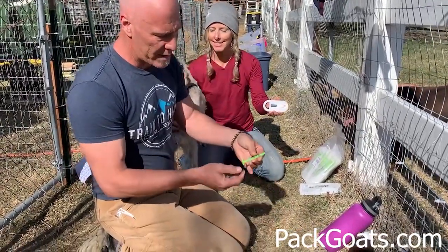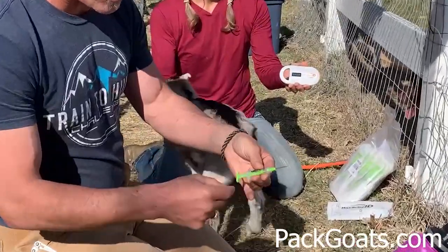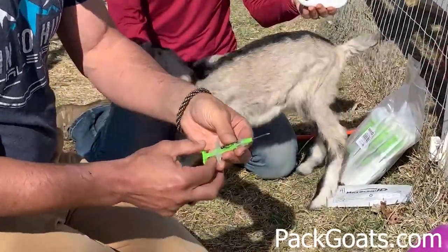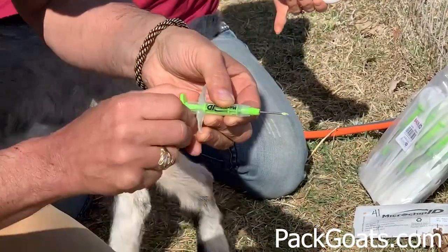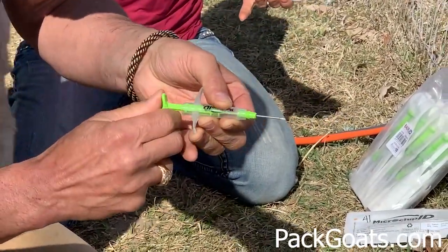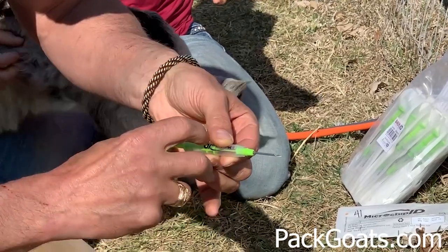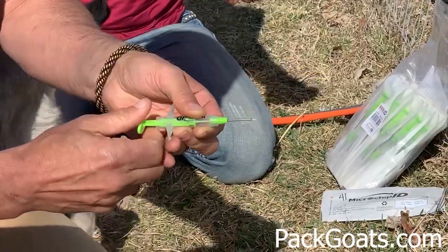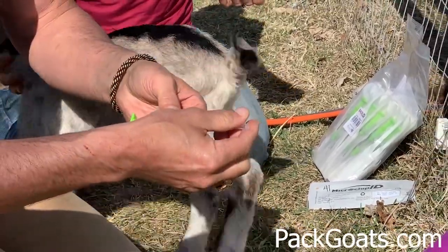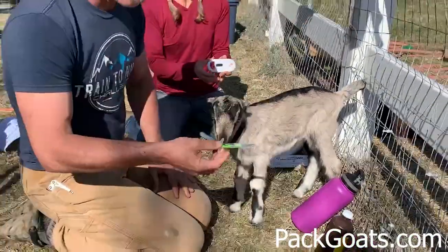What it is — this is one that's already been plunged, I've already shot this into another goat. If you'll actually see, you see a little green piece come out right there. It's got an audible click to it. So when it starts, you put it in the tail and you click, and then you know the microchip's in there. You read it beforehand and then you read it after it's in the goat and you verify that it's in there.